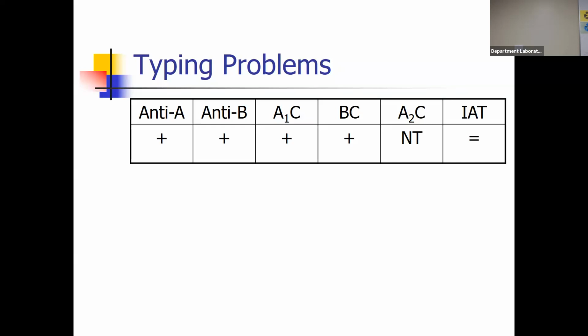You guys remember we talked about polyagglutination? All right, so if you were to test A, B as well, your D and your D control, they're probably all going to be positive. What is something that we could do? Probably your patient cells are coated with something that's reacting with our reagent.